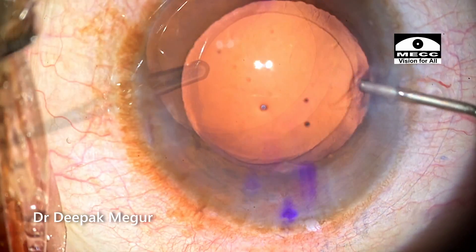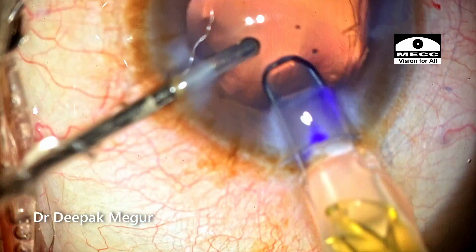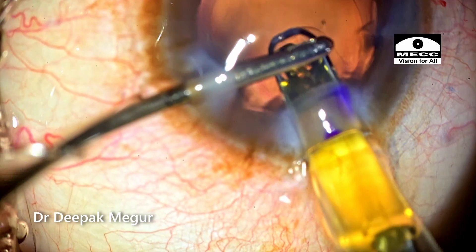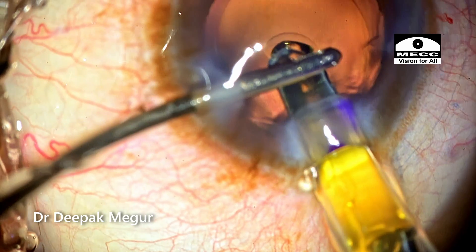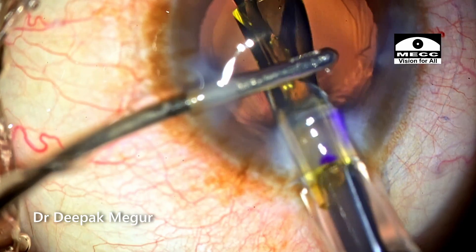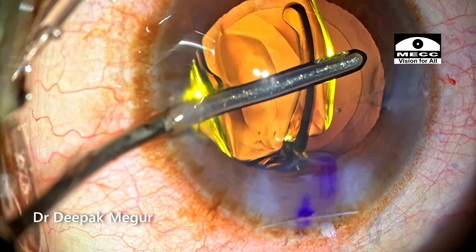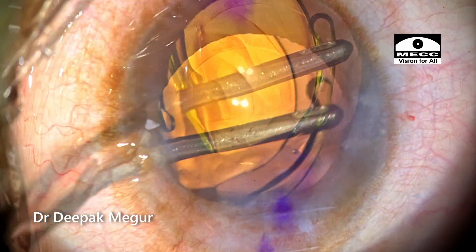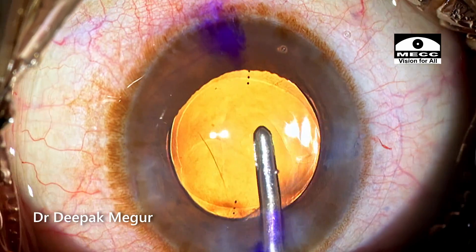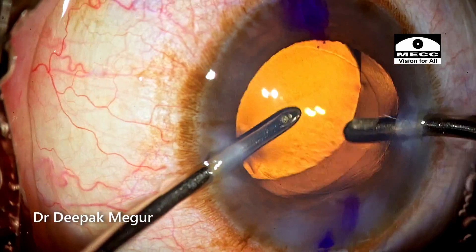Hydro-implantation of the toric intraocular lens is being done now. The irrigation cannula is being held with my non-dominant hand as the intraocular lens is being implanted into the capsule bag. The cannula will be held above the level of the cartridge so that the haptics and the optic of the unfolding lens don't jump up. The irrigating cannula is in fact used as a guide to nudge the intraocular lens into the capsule bag. Although no OVD has been placed into the bag, there will always be some OVD sticking onto the under surface of the lens which we have used in the cartridge.